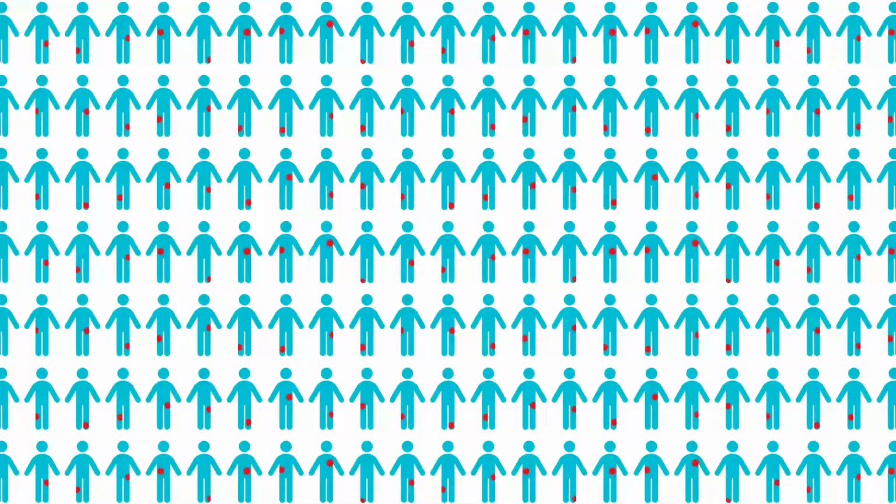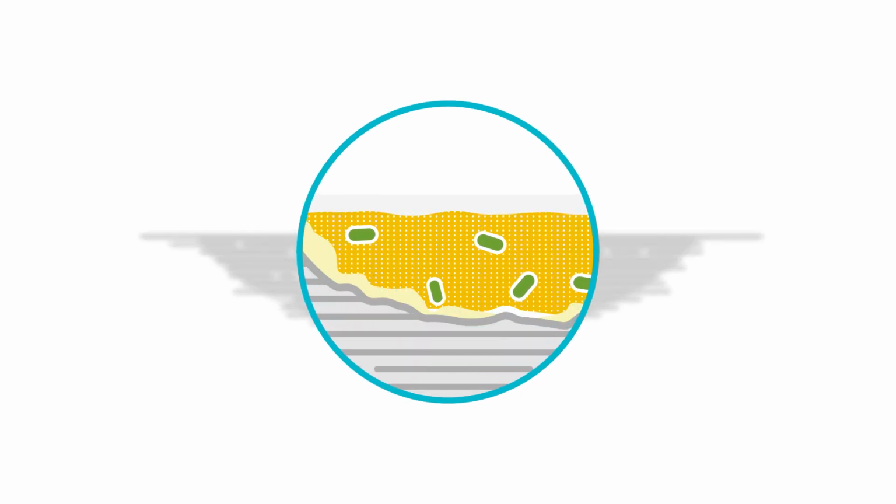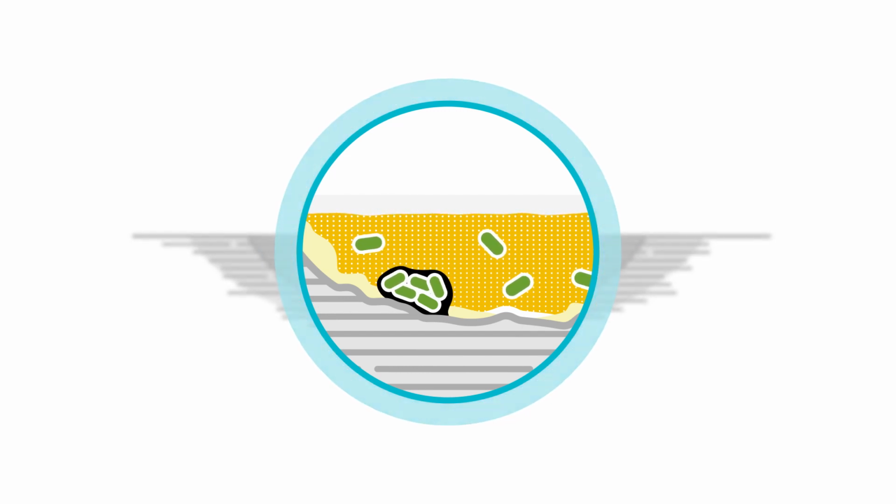Infections, or the risk of infections, are a common challenge when treating patients with non-healing wounds. Infected wounds are often characterized by the presence of increased exudate, slough, and non-viable tissue. This creates an ideal environment for the further growth of bacteria and fungi, and subsequent development of biofilms. Biofilms are clusters of bacteria and fungi embedded in the wound environment. They can form within 24 hours and are difficult for the immune system and antibiotics to eradicate.